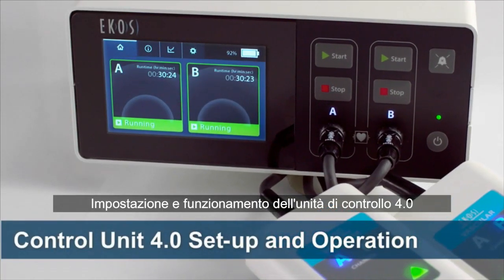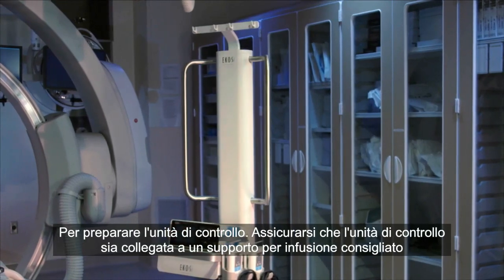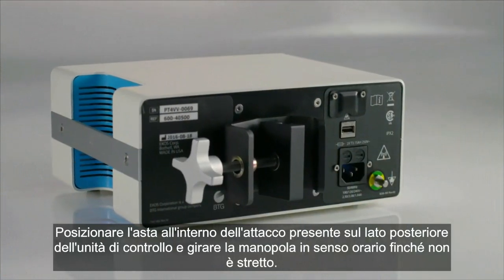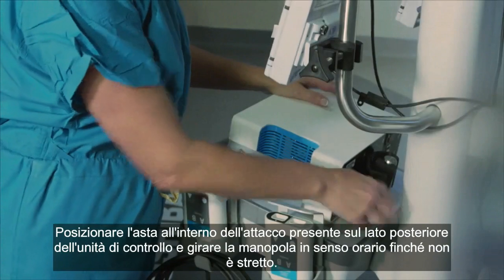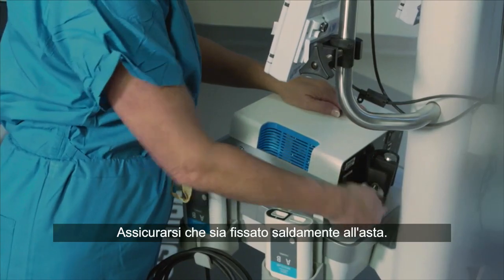Control Unit 4.0 Setup and Operation. To prepare the control unit, ensure the control unit is attached to a recommended infusion stand or placed securely on a table or cart near the patient. Place the pole inside the mounting bracket that is located on the back of the control unit and turn the knob clockwise until it is tight. Ensure that it is securely attached to the pole.